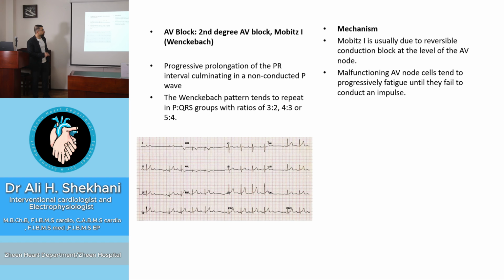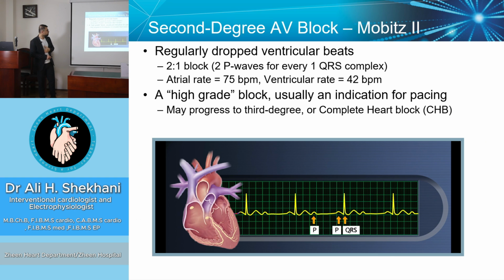Usually it is due to the level of the block. In Mobitz type 1, it is in the AV node, and it's due to progressive fatigue until they fail to conduct the impulse. It is not structural disease, it's only functional. However, we have Mobitz type 2.